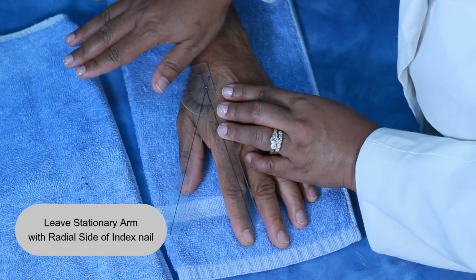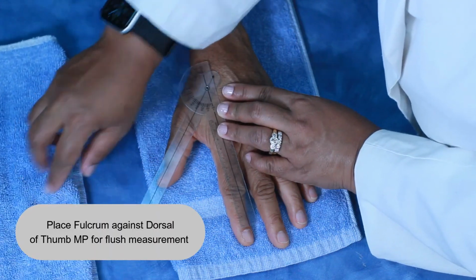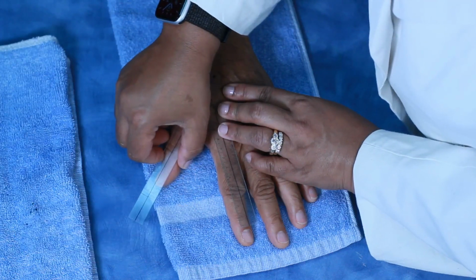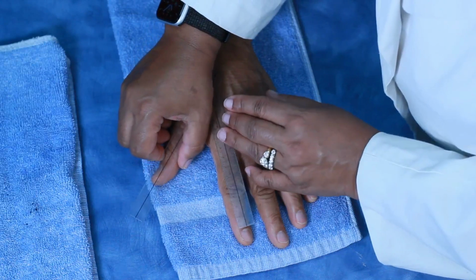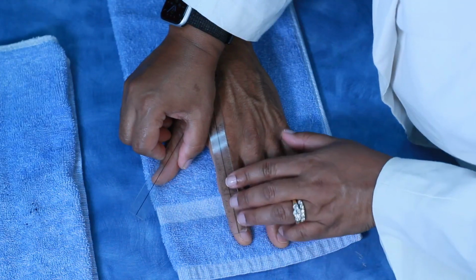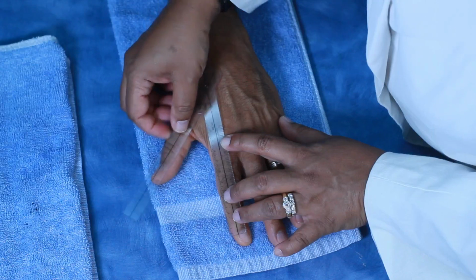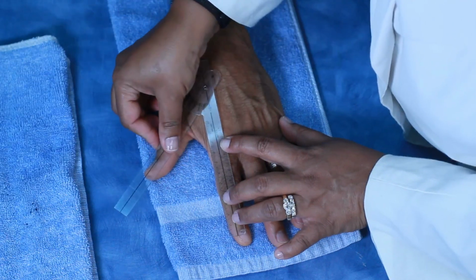So I'll ask the patient to bring his thumb out, and in this particular case I am getting him at roughly 50 degrees of range of motion. So I just want to make sure that my stationary arm is where it needs to be, my movable arm is where it needs to be, and my fulcrum is in place, and he's got just a little bit more here. So that's at 50 degrees.